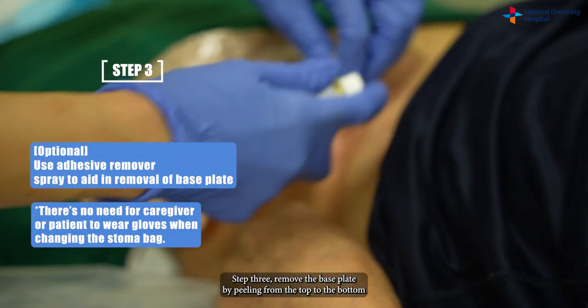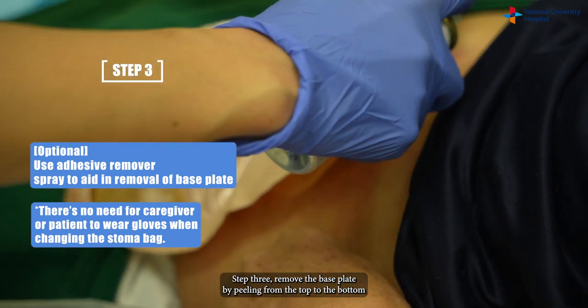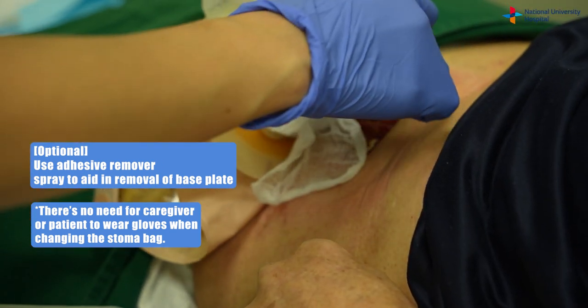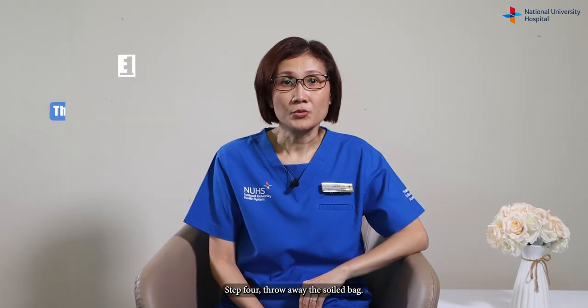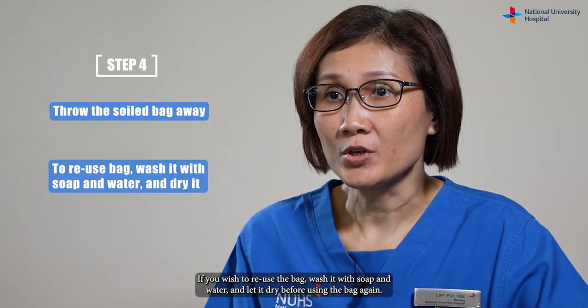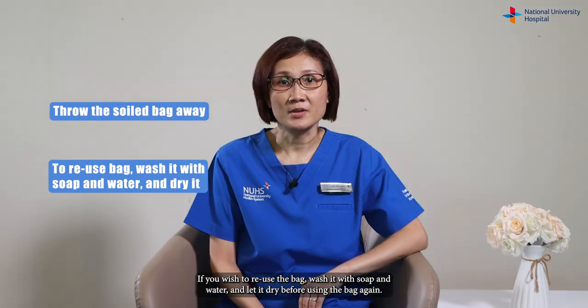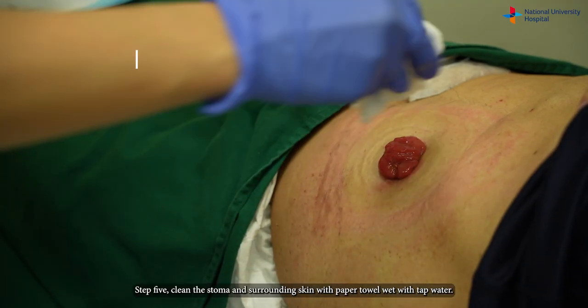Step three: remove the base plate by peeling from the top to the bottom with one hand pressing against the skin. Step four: throw away the soiled bag. If you wish to reuse the bag, wash it with soap and water and let it dry before using the bag again.